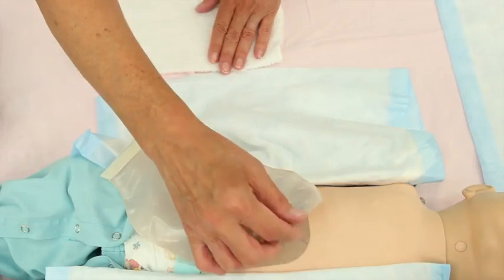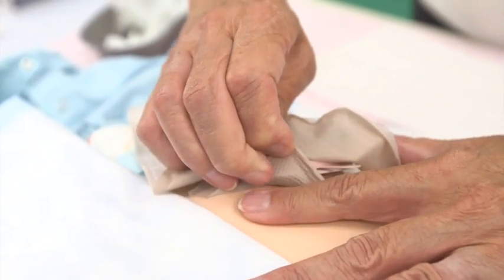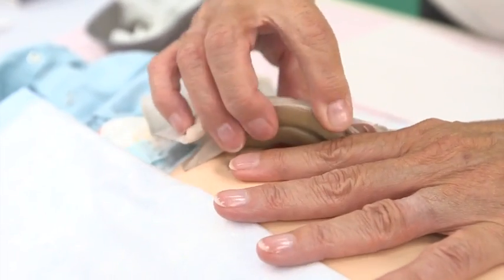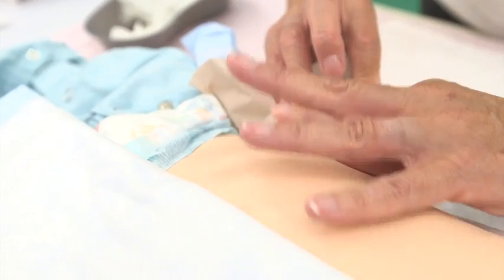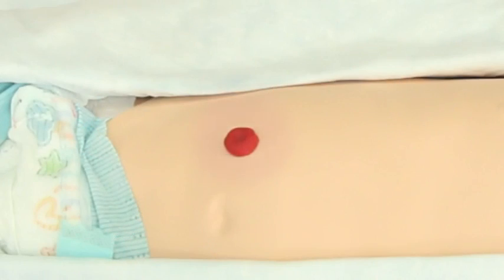The appliance is removed by applying light pressure on the skin with one hand and gently pulling the appliance from the skin with the other hand. These products are made to adhere to the skin, but also to be removed comfortably when it is time for a change. The skin may appear pink after the old appliance is removed, but this should fade.